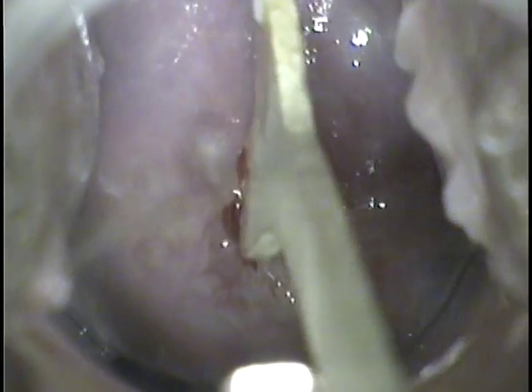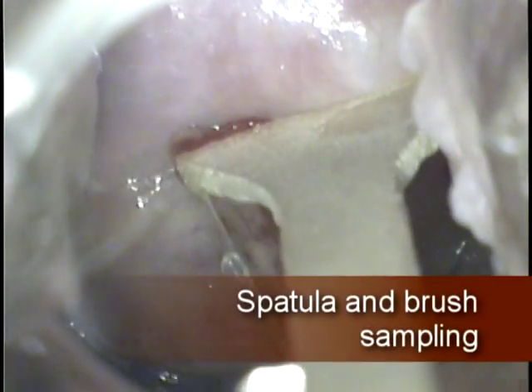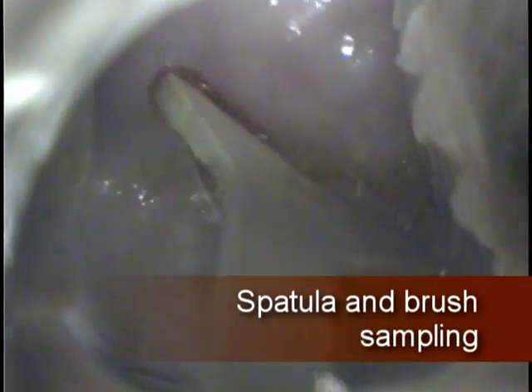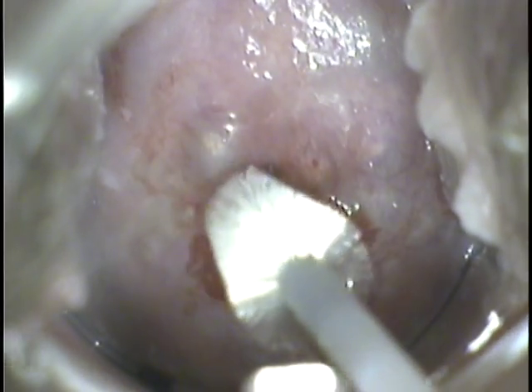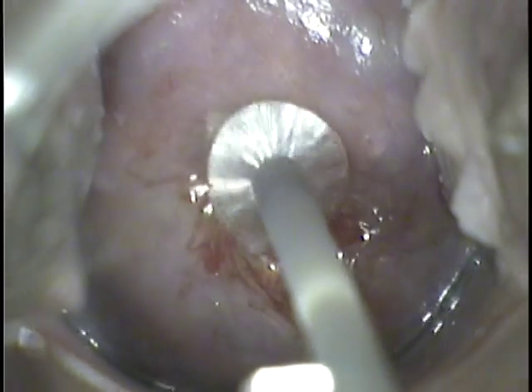Perform the Pap smear in several ways. Using a Pap spatula, place the tip of the spatula within the os and rotate the spatula several times to collect cells on one face. When spreading the spatula over a slide, one must take care that the side laden with cells is spread over the glass surface.